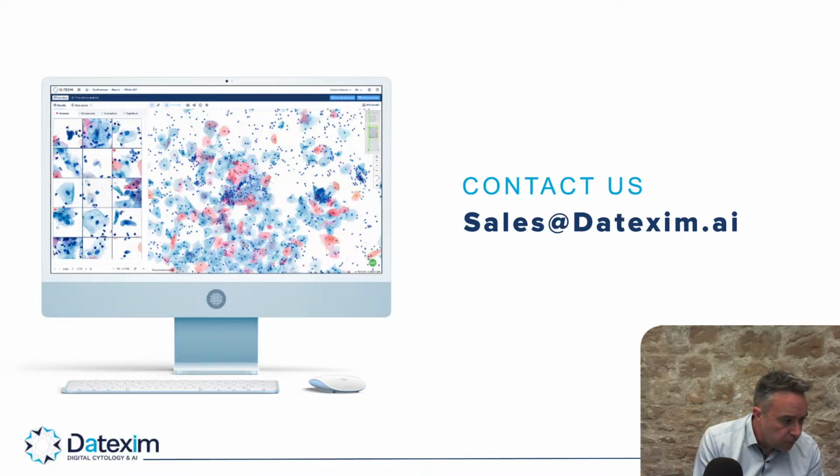I have another comment here. I believe Leica is launching this stack. Do you have an idea on how it will be available? We don't have an idea yet. They launched this stack. They will have their own extended depth of focus algorithm, and we will probably work on this scanner with this new feature to adapt it to ThinPrep. So more information to come on that in the next month.